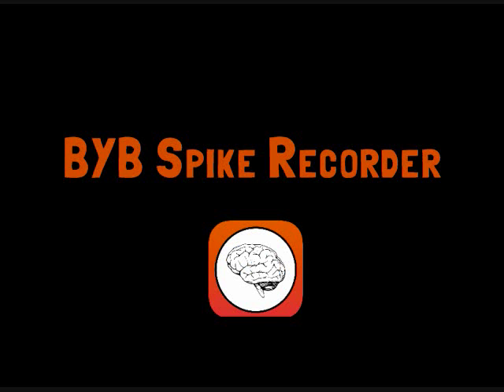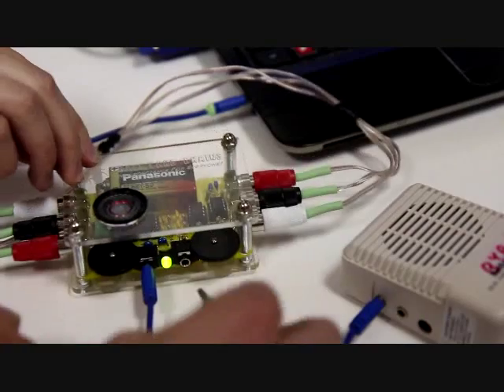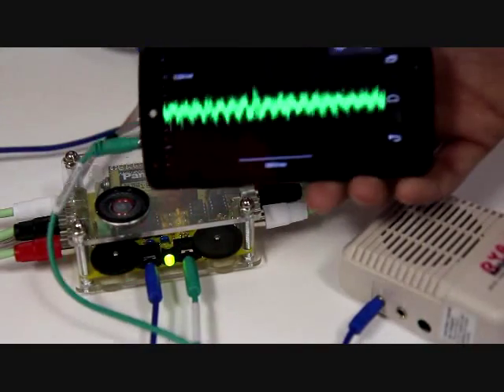Next, open up the Backyard Brains Spike Recorder software. This is available for free on backyardbrains.com. Or if you don't have a computer handy, you can always use the Backyard Brains app on your smart device instead.